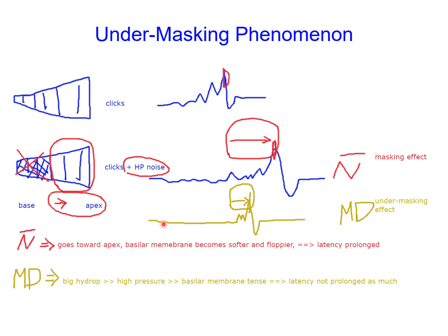So the ABR waveform evoked in patients with Meniere's disease is plotted in light green here. I don't know what color you want to call it. Let's say yellowish green, greenish yellow. This yellowish green waveform is the ABR wave you would obtain in patients with Meniere's disease. In this case, the prolongation of ABR wave V will not be as much as it should be when compared to normal patients.